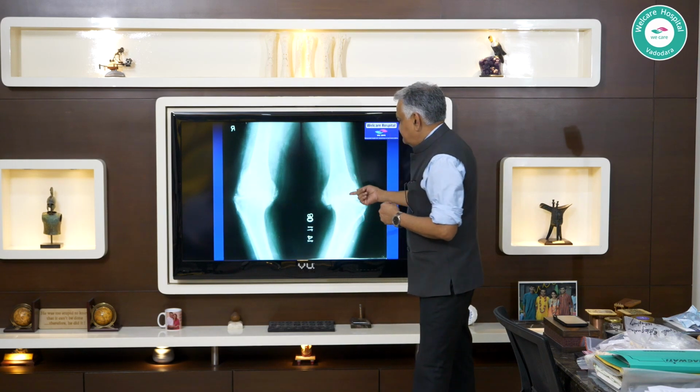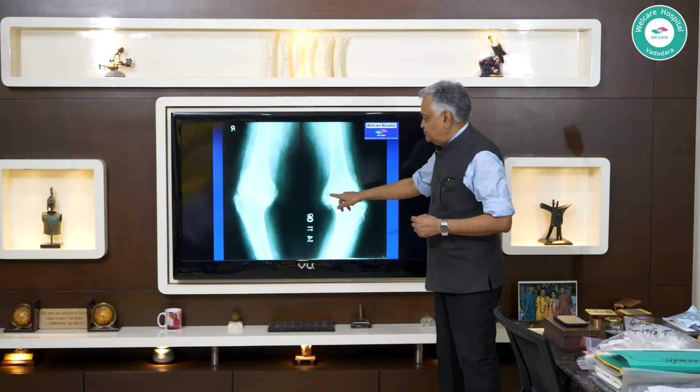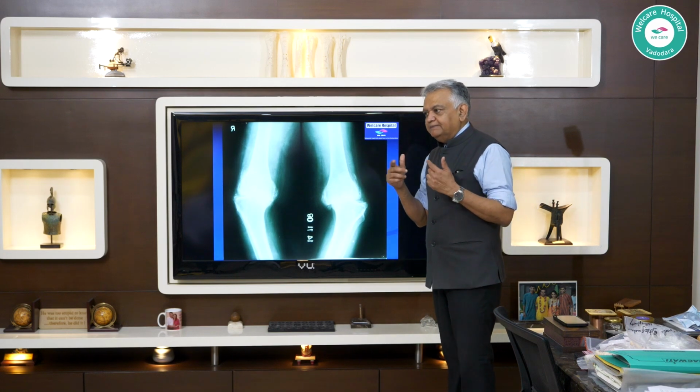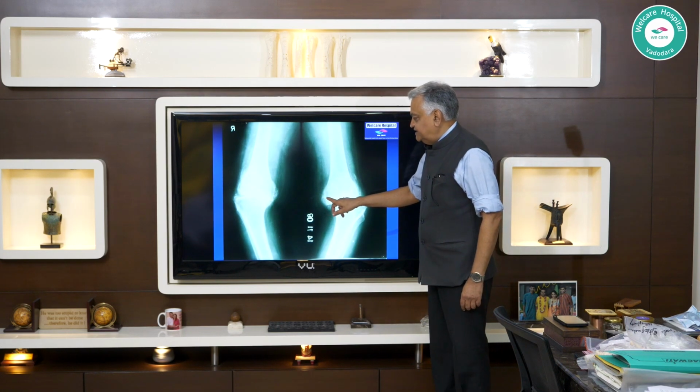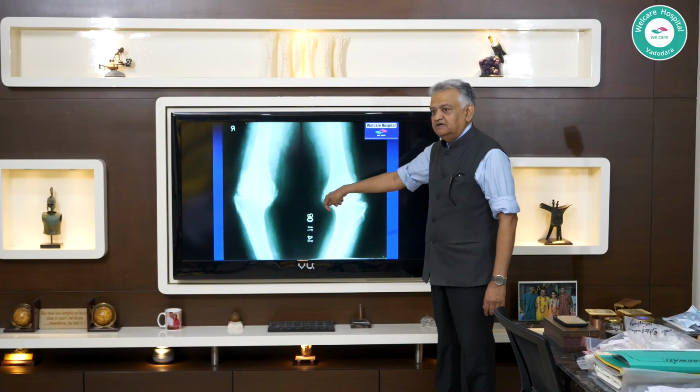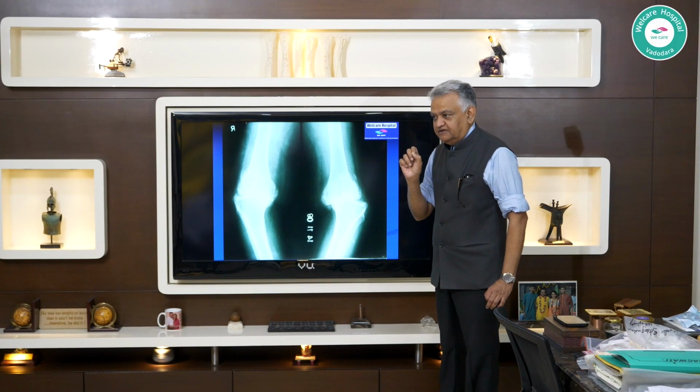So my point is, work it backwards. My brain has perceived this osteophyte. You guys have even described it, but you have not translated it into a surgical action on table, which is what I want you guys to encourage yourself to be capable of doing. My brain has already translated that, okay, when I go here, first I will safely take this osteophyte out so that I decompress this ligament, and that makes it safer.